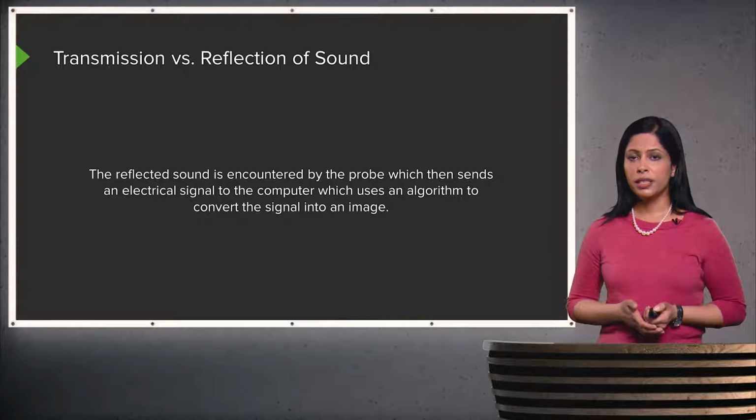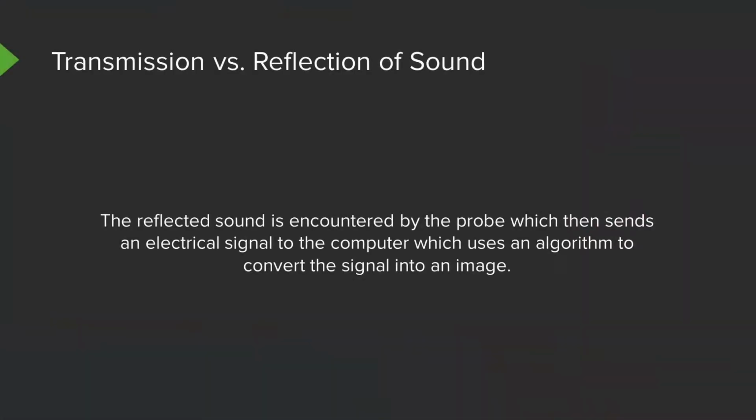The reflected sound is encountered by the probe, which then sends an electrical signal to the computer, which then uses an algorithm and converts that signal into an image. And this is what we see on our screens when we evaluate an ultrasound image.